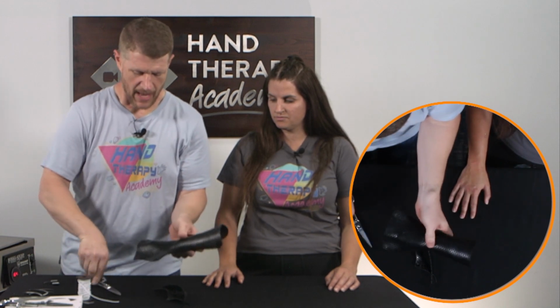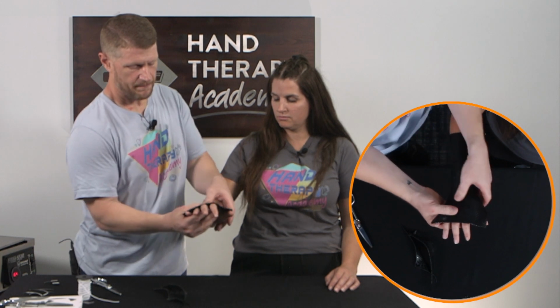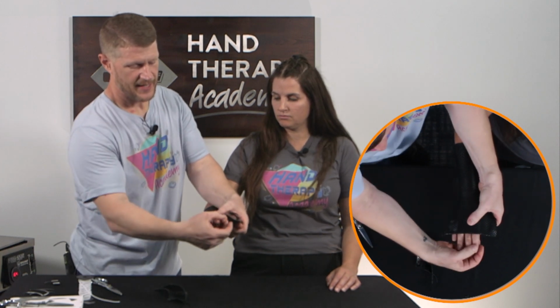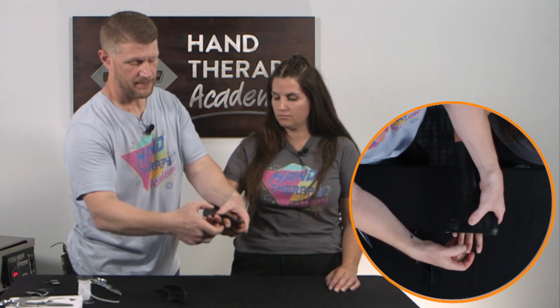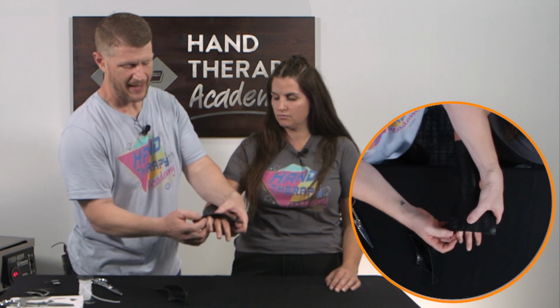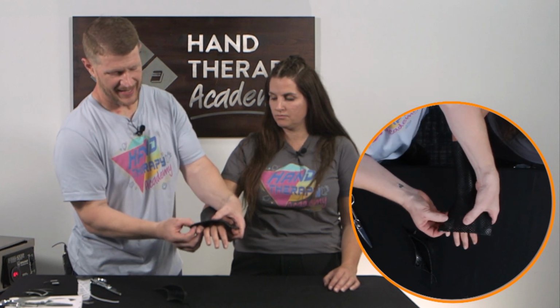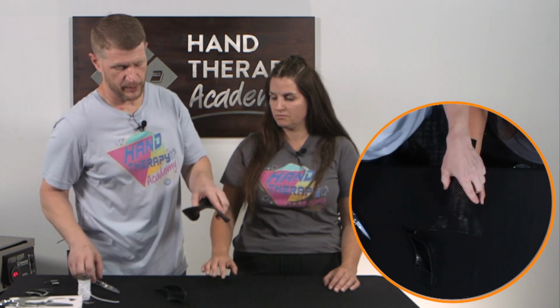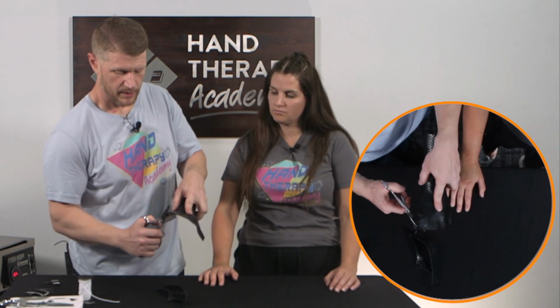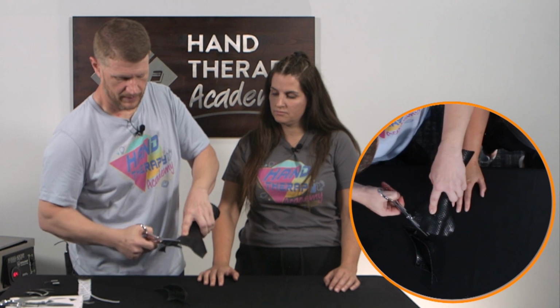And then I'm going to put this back on her, and again, like she said, I may mark it, but I'll also see that the index finger at the apex of that PIP is good. That one's good. This one needs to come down a little bit. It doesn't need to go past, and it only ends up being a catch point there. So I'm coming down like 2 holes, and then I can kind of see where that was on the small fingers. So I'm going to take it wide and angle it like that.